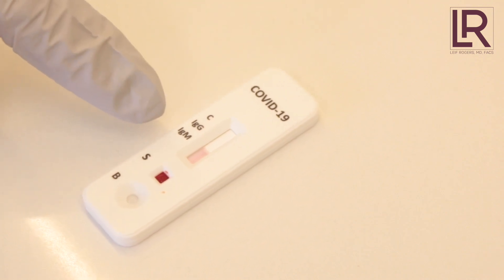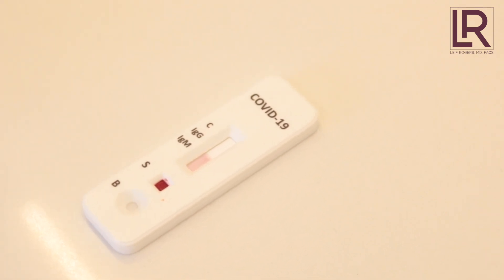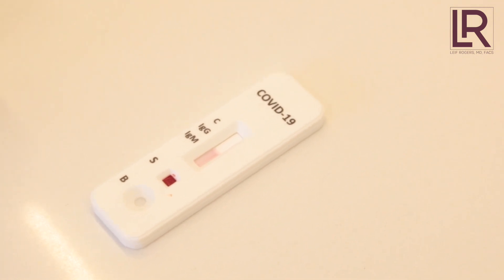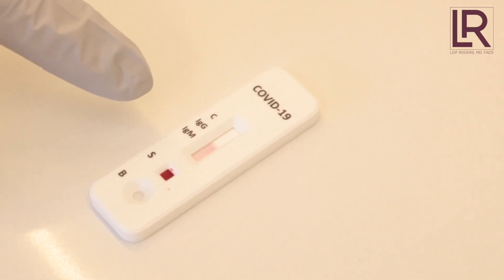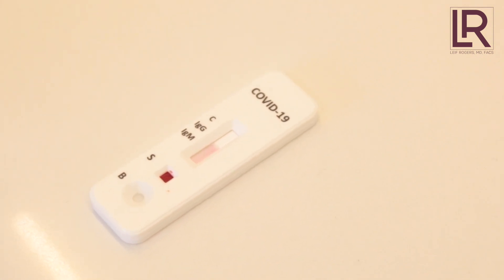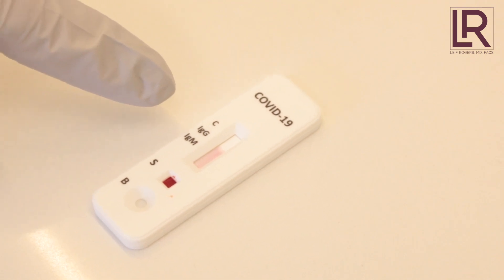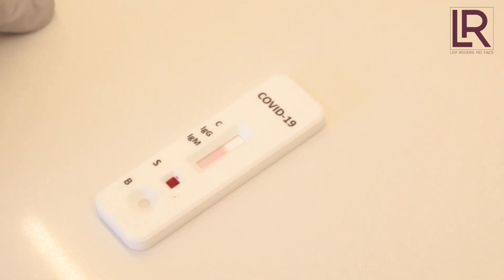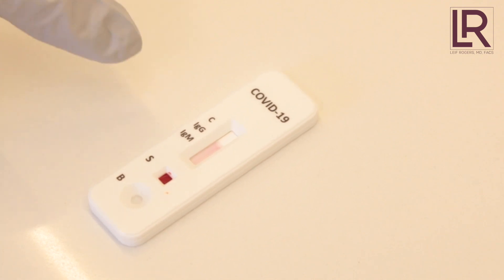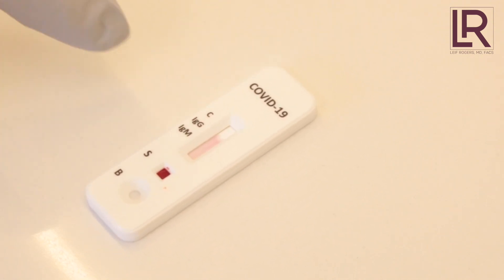Usually it appears pretty quickly. IgM — nothing, no IgM line. So you're definitely not showing any early reaction. IgM happens when you first get the COVID virus and your body starts to produce an immune response. After a while the IgG kicks in and those stick around while the IgM goes away. It doesn't look like you have IgG either, but we're going to keep waiting.